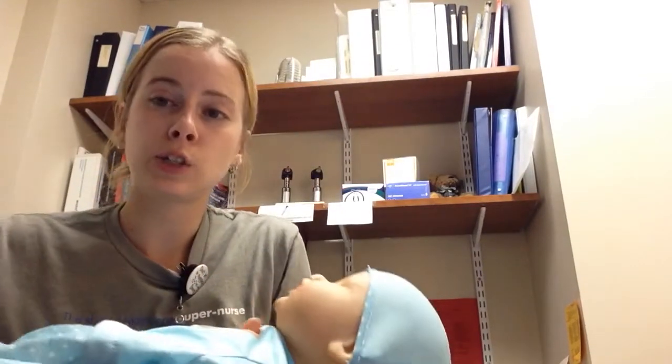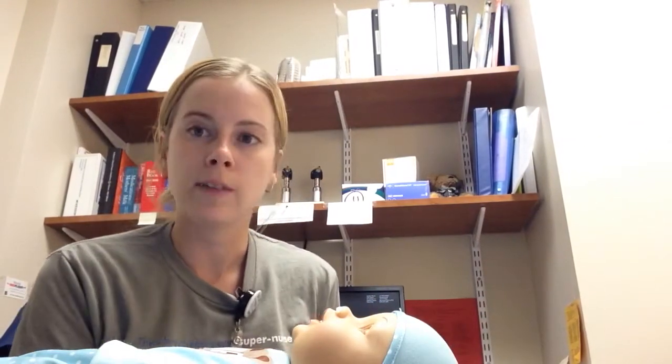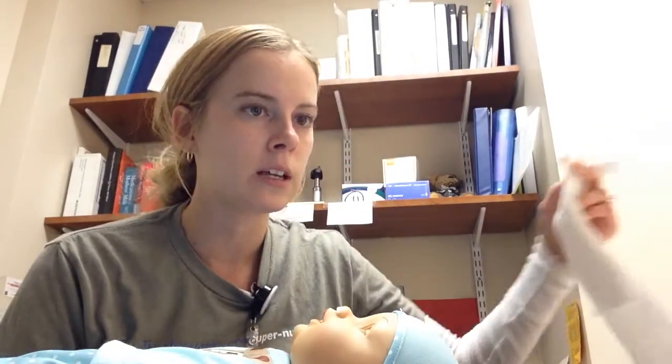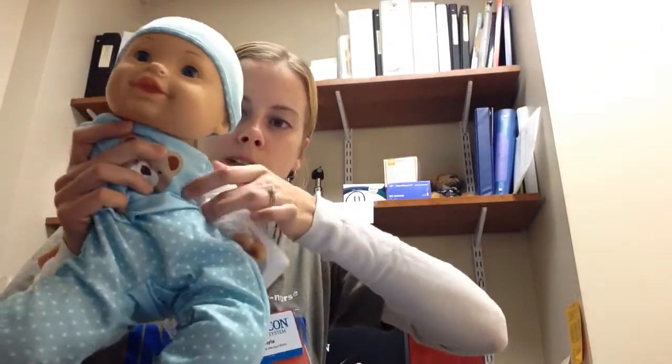One of the biggest things too is that we know kids' first reaction is to pull the IV site, and that's why people's first instinct is to cover the IV site so that they don't see it. So we actually have these stockinettes up here on Pediatrics, and they're the only thing that is approved to cover the IV because we can easily pull it back to see it. And so they just go over the arm board. And then anytime you need to look at the IV, it's as simple as pulling this up to look at it.